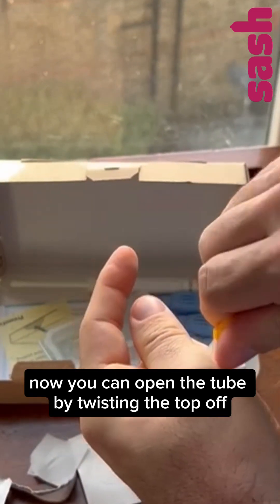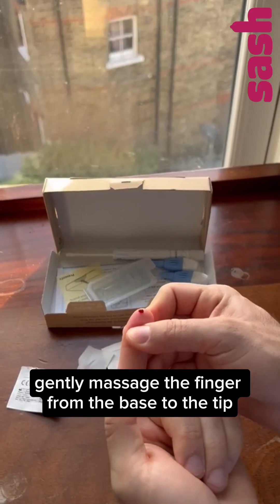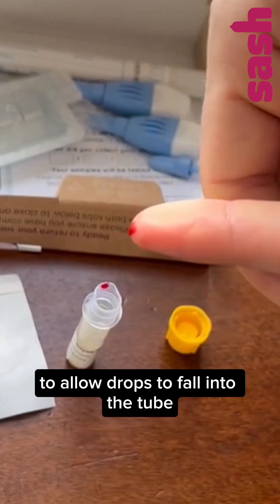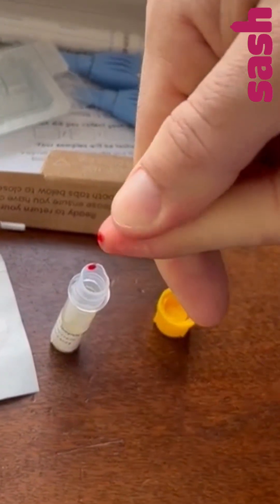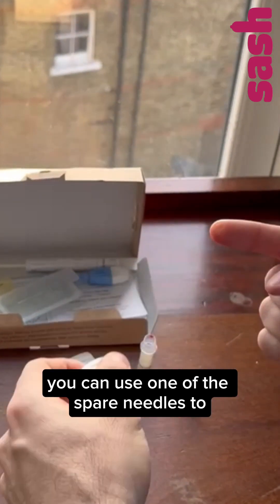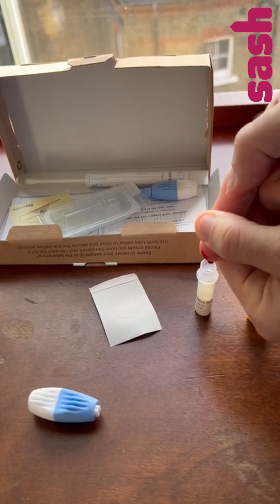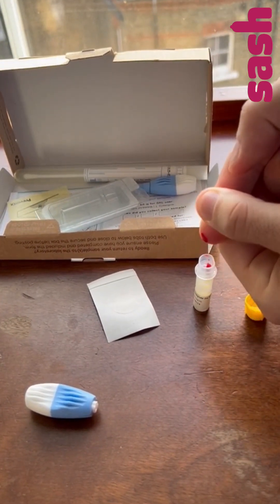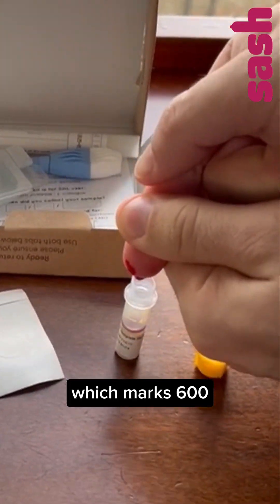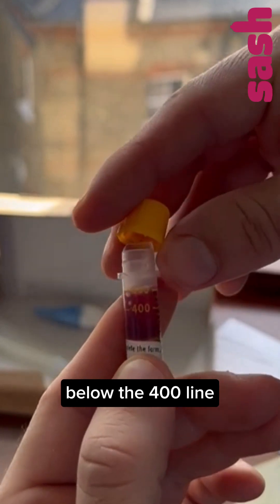Now you can open the tube by twisting the top off. Gently massage the finger from the base to the tip by using a milking motion to allow drops to fall into the tube. If you were unable to collect enough blood, you can use one of the spare needles to try another finger or two if needed. Fill the tube to the upper line on the side which is marked 600. The test may not be successful when it samples below the 400 line.